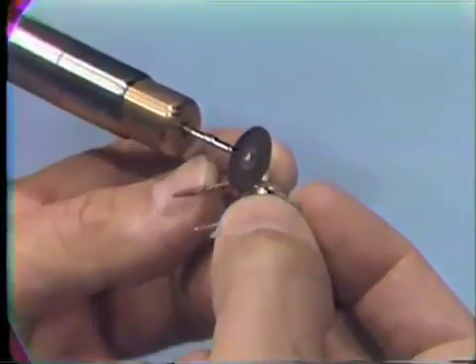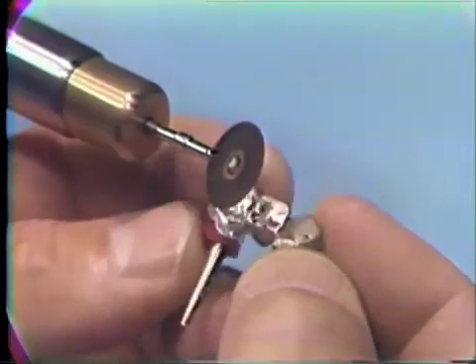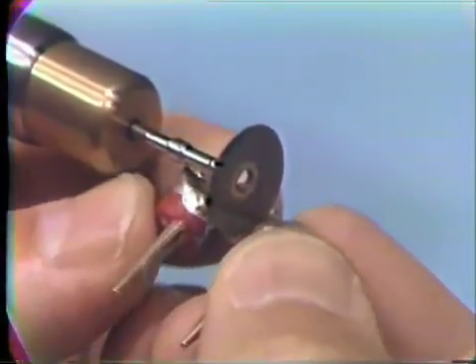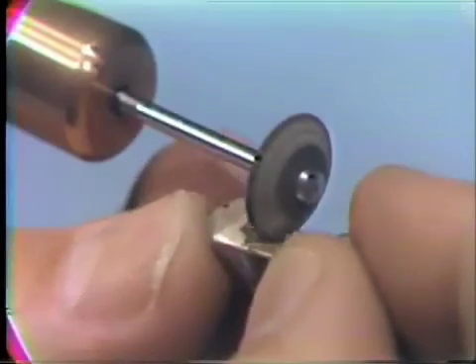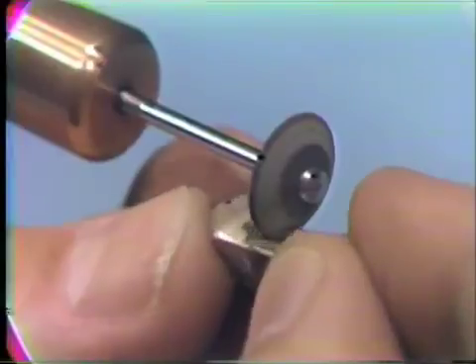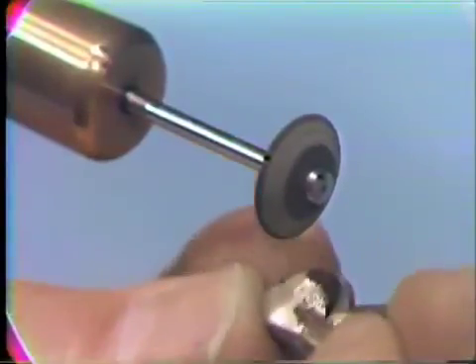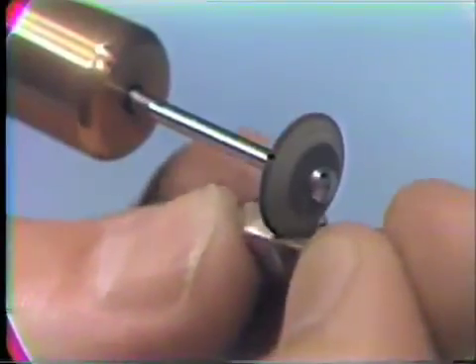It's important when polishing to stay away from these centric stop areas. Here we are using an automatic chuck and a sand disc to further refine the margins and the contour on the lingual surface. A rubber wheel is used to further polish the interproximal and lingual surface — the rubber wheel has been sharpened so it will fit into this interproximal area.